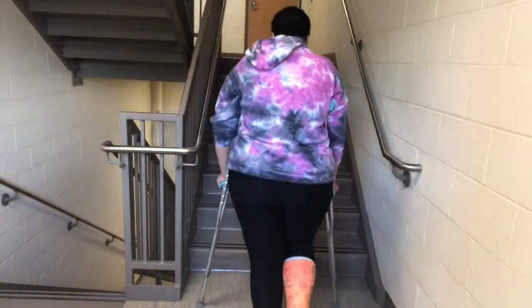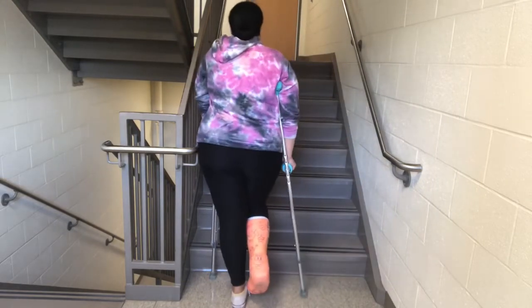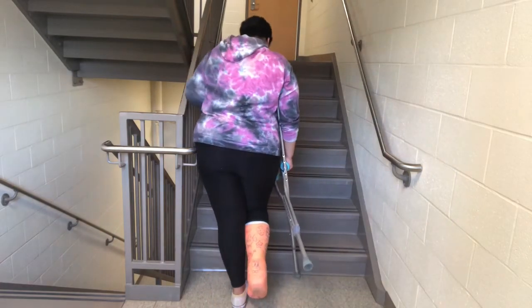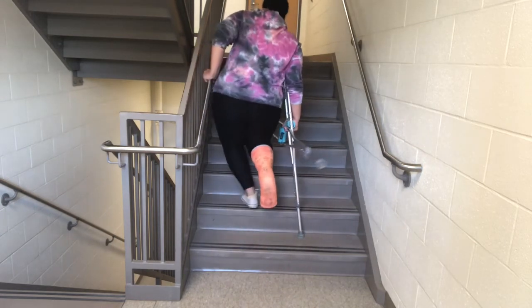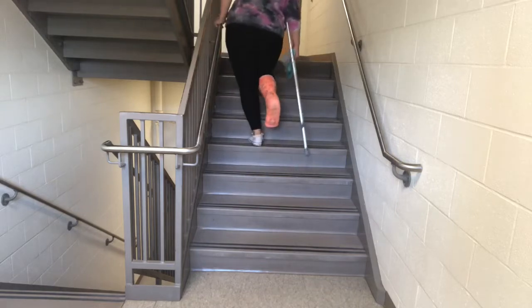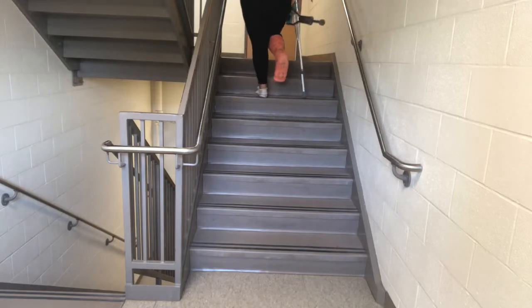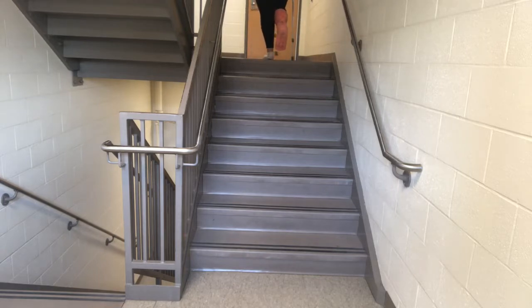This next clip is of me using the stairs going up. First, line yourself up with the railing and transfer the crutch you won't use to your other hand — a friend can hold it for you. Put your crutch up on the stairs, grab the handrail tight, and hop up. Keep your hops really small and go really slow so you don't trip or fall.